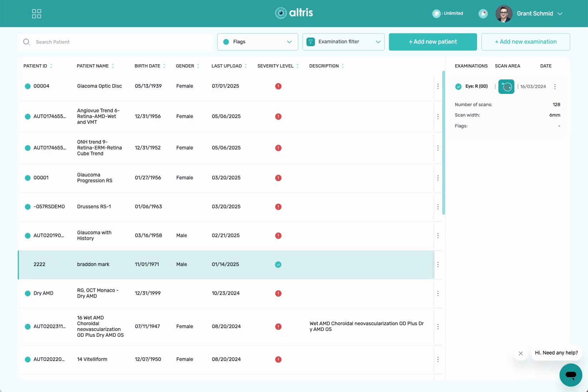This is a demo of the Altru's AI system. I'm logged in and this is my home screen. From the home screen, you have the ability to filter by a lot of different factors.